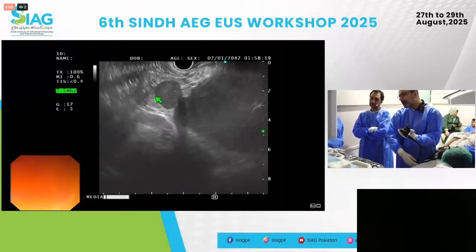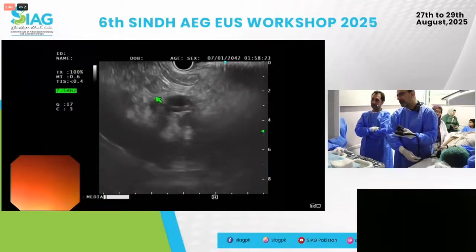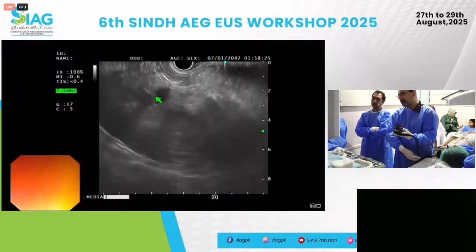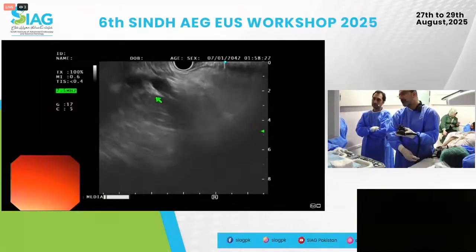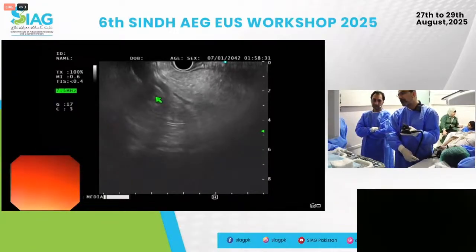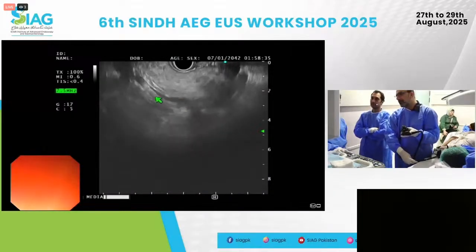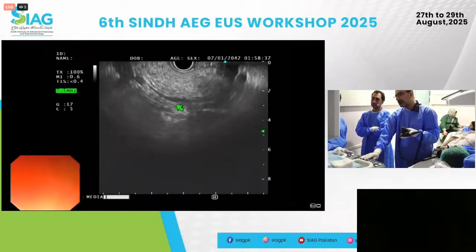To the left of it, as I push in and go counter, you will see kidney. So that's the left kidney. And if you can see the left kidney, you pull back on the kidney. And if you go counterclockwise on the kidney, you'll get the left adrenal, which is this guy here, right there. This is your left adrenal.